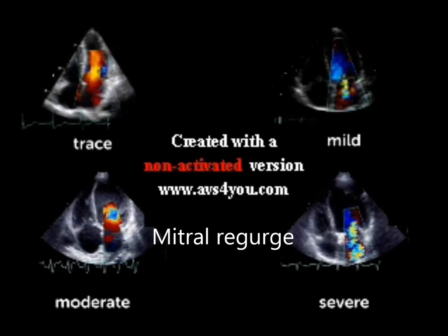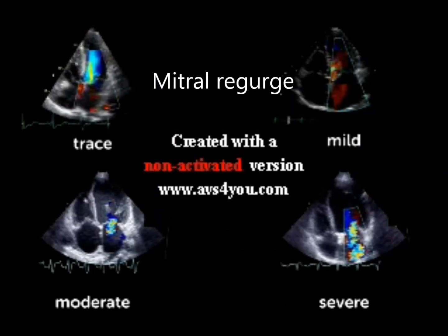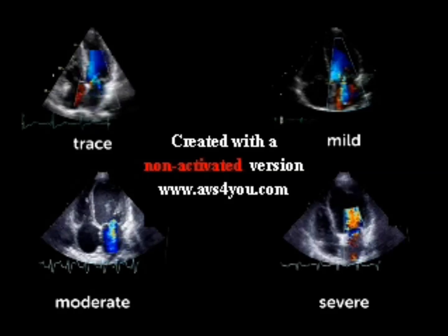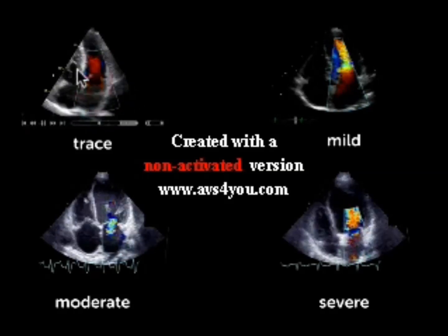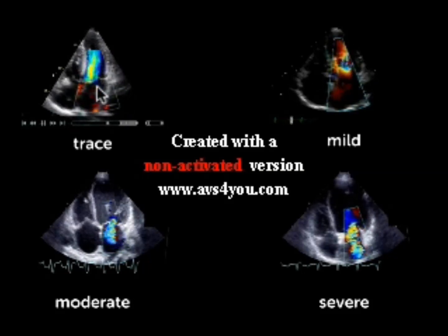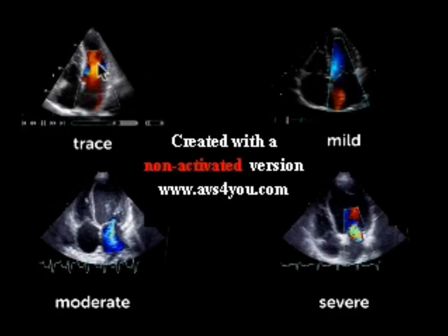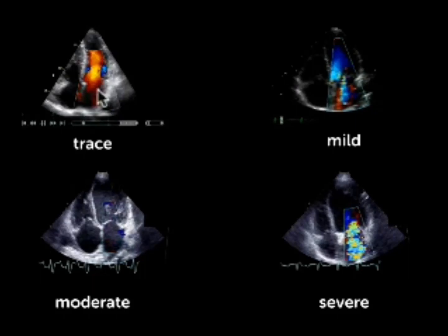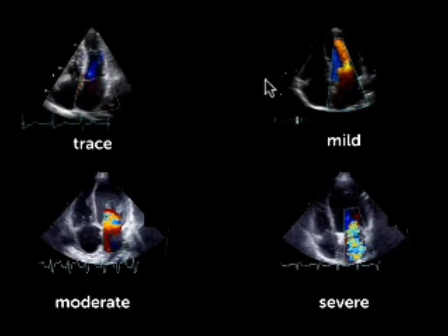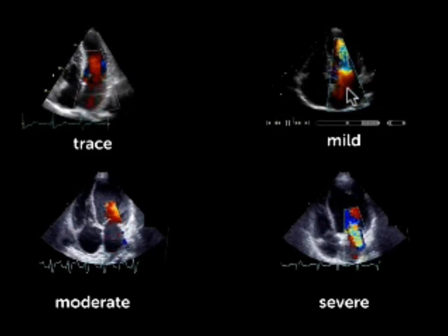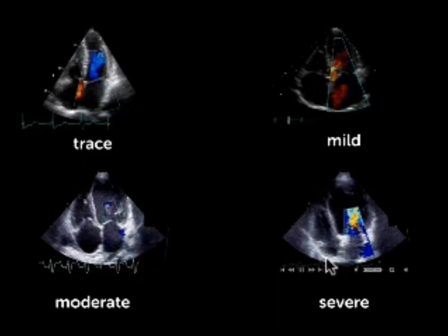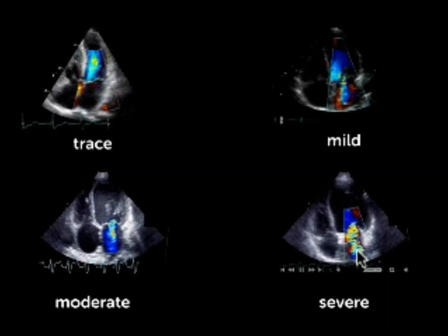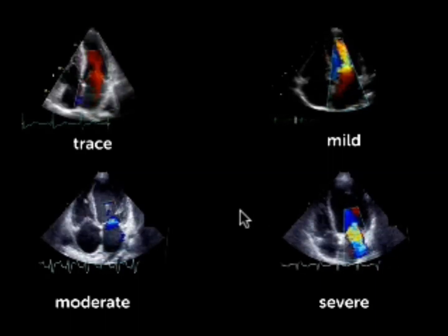To quantify mitral regurgitation, the size of the jet plays a role. Here are four examples showing four different degrees of mitral regurgitation. The jet must be blue because mitral regurgitation flows towards the left atrium — away from the transducer. The first example shows just a very small blue flame; it gets progressively larger in the subsequent examples, with the last showing a very large jet with mosaic colors indicating high velocity, which is typical for mitral regurgitation.